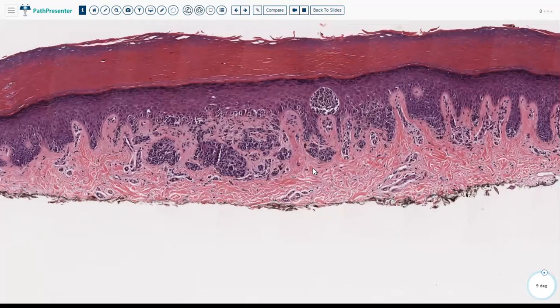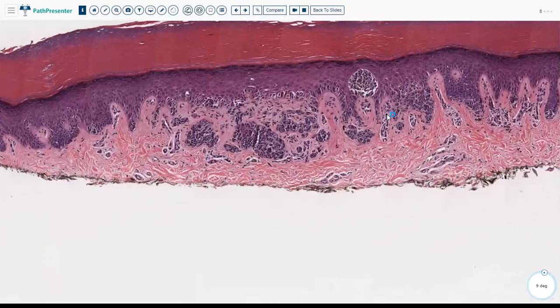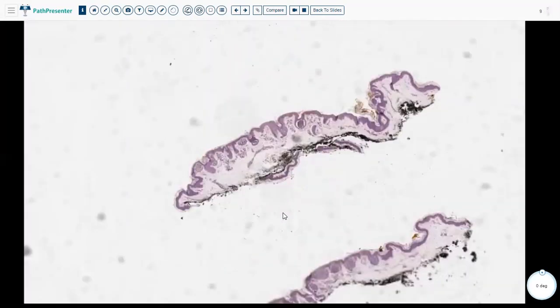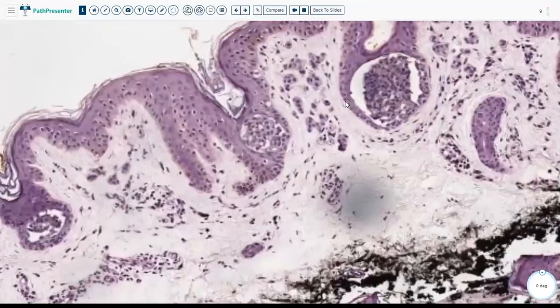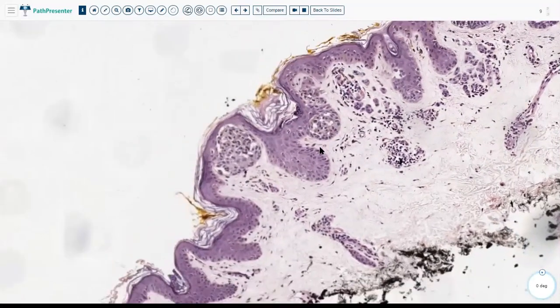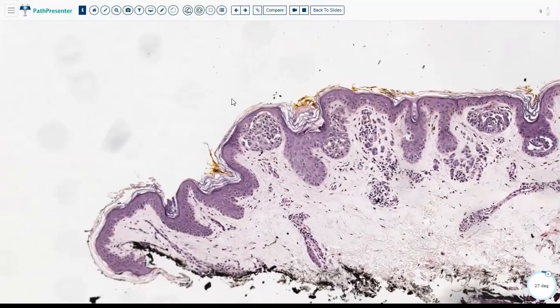We don't have any largeness going on deep into the dermis. I wouldn't even call it mild, because it still has some nests in the dermis, but you always downgrade them when you find them in the acral areas. And this is another example, which is in the ear. You can see here how you can have a very large nest in the dermis. I don't want to use these examples to confuse you, just to enlighten you into the idea that some areas of the body are allowed to have some atypical features.